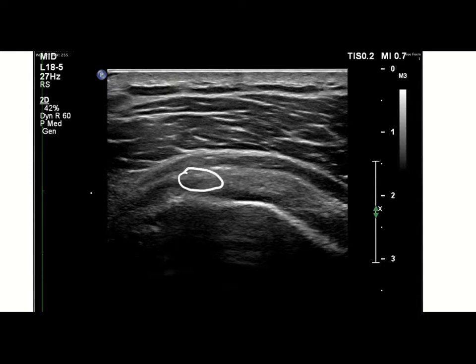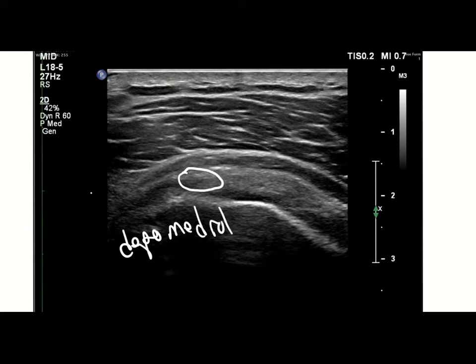You can see this hyperechoic fluid — this is the particulate corticosteroid. Both Depomedrol and Triamcinolone can cause this hyperechoic reflector. It's not a good idea to inject this right at the beginning, because if you inject air or a lot of particulate corticosteroid you can get posterior acoustic shadowing, which can really get in your way if you're trying to do another injection deep to your injectate.